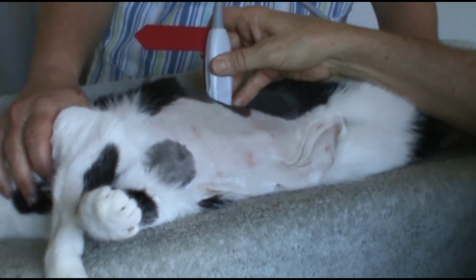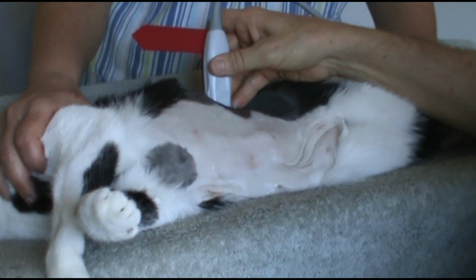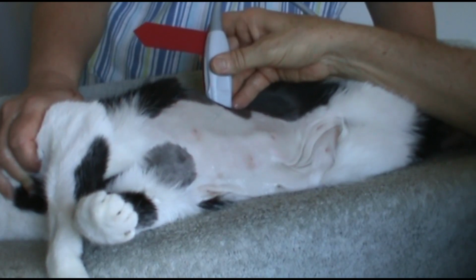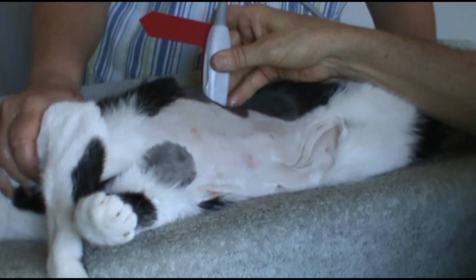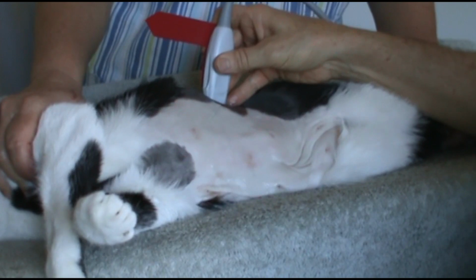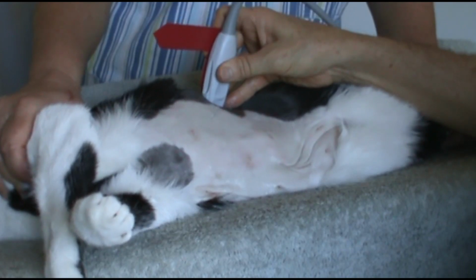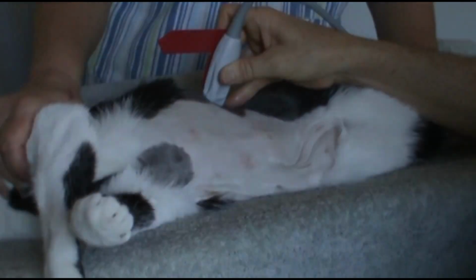Sometimes it is necessary to tilt the patient slightly to its right to improve transducer positioning from the left lateral side. In cats and in most dogs, the left kidney and the left adrenal are caudal to the last rib on the patient's left. In some dogs, the left kidney and left adrenal are cranial to the last rib, making it necessary to look for the left adrenal between the ribs.